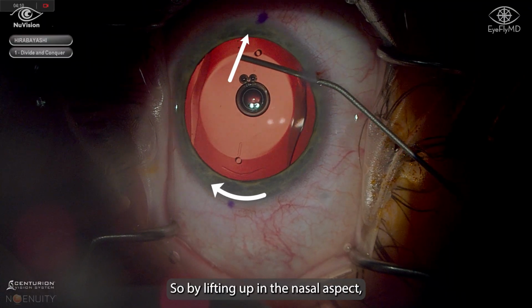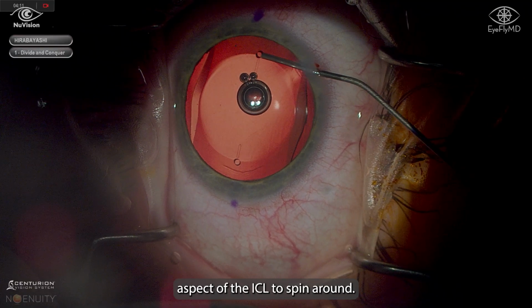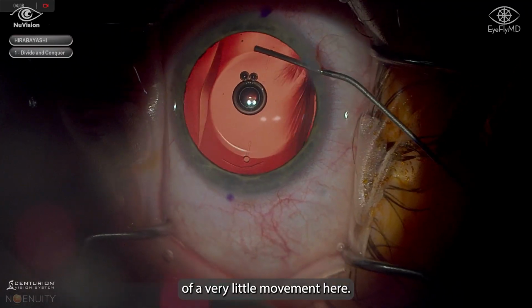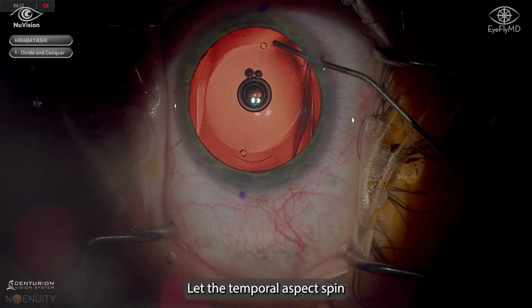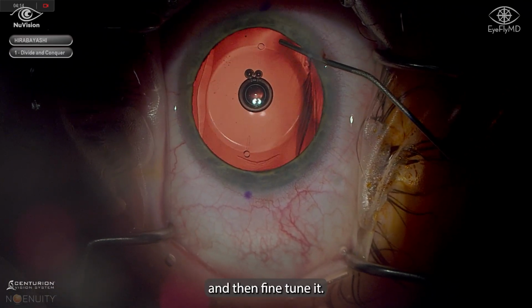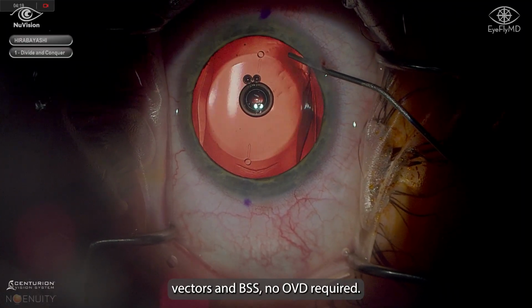So by lifting up in the nasal aspect, see how it allows the temporal aspect of the ICL to spin around. Got a large motion out of a very little movement here. So here it is again in real time. Lift, let the temporal aspect spin where you want it to, and then fine tune it. And this was all using force vectors and BSS, no OVD required.